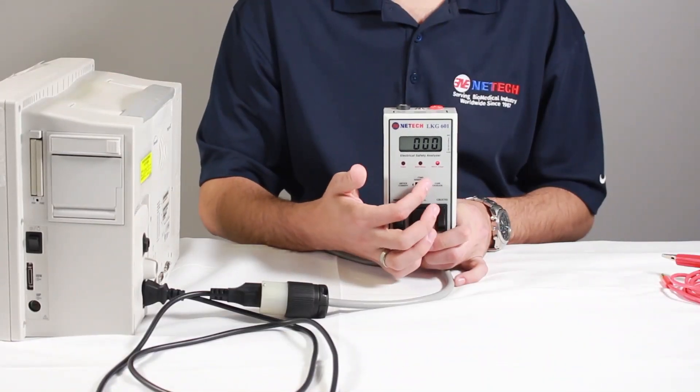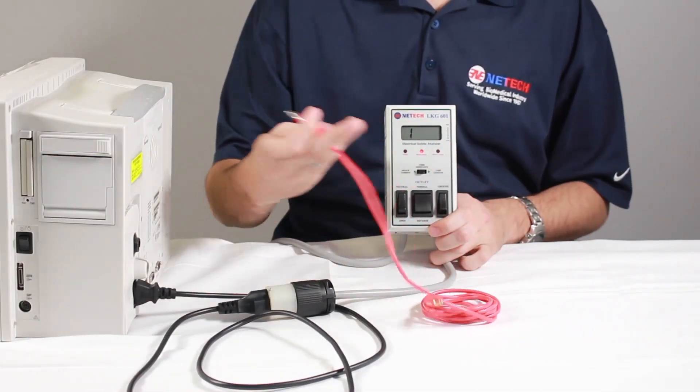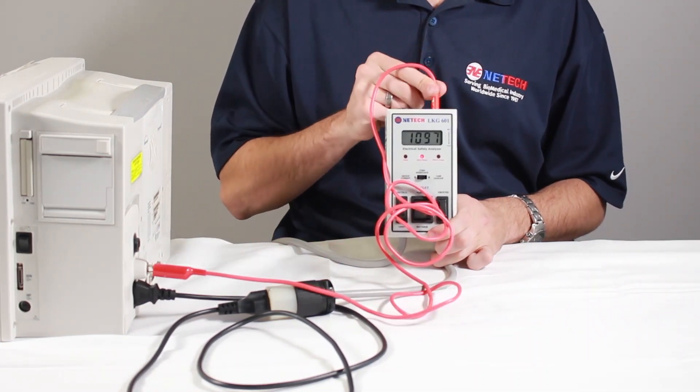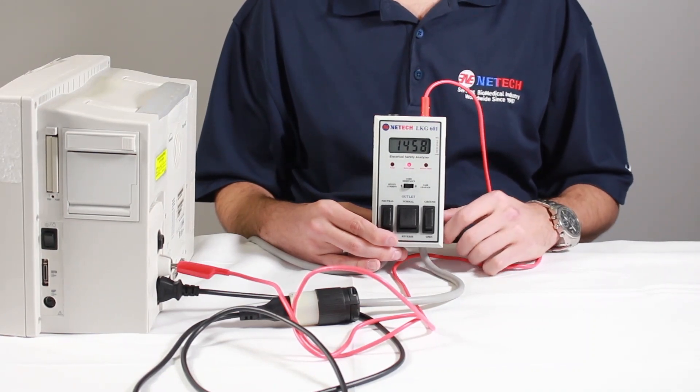Now move the three-position slide switch to cord resistance. Using the test lead provided, connect the chassis of the device under test to the case ground jack on the LKG601. The result will be measured in milli-ohms and displayed on the LCD screen as shown.